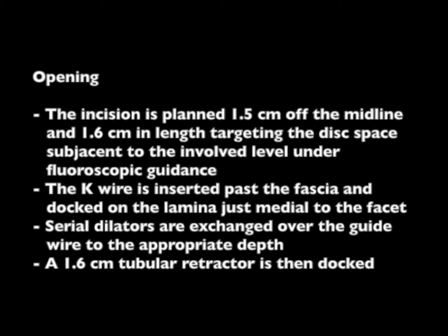The K-wire is inserted past the fascia targeting the disc space under fluoroscopic guidance and docked on the lamina just medial to the facet. Serial dilators are exchanged over the guide wire to the appropriate depth. A 1.6 cm tubular retractor is then docked.